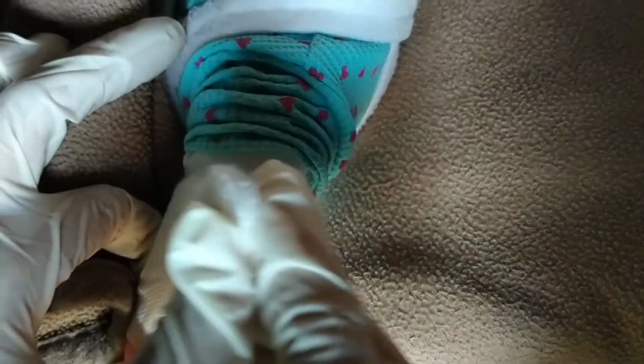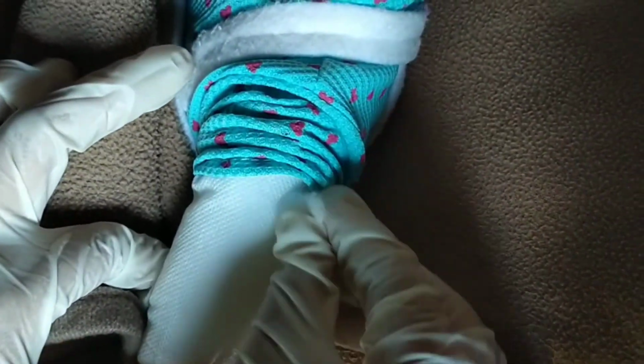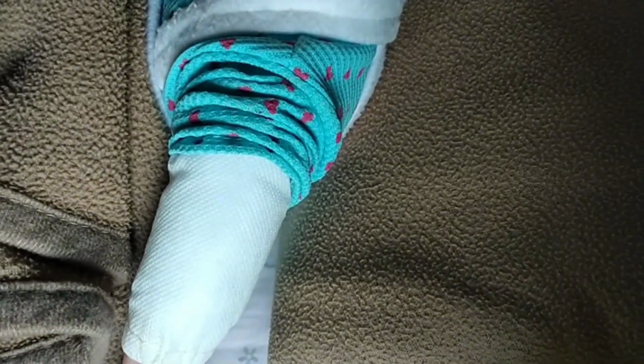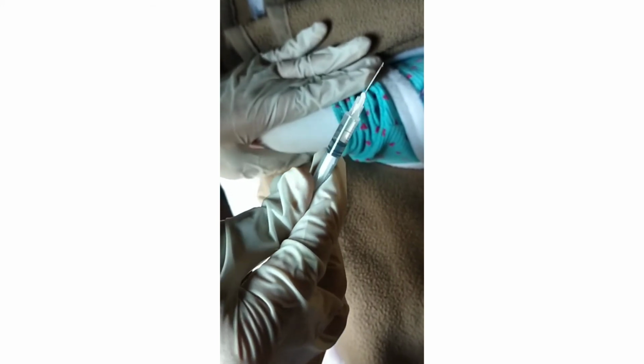Clean the site with an antimicrobial swab, wiping with a firm circular motion and moving outward from the injection site, and allow the skin to dry. Remove the needle cap with the non-dominant hand by pulling it straight off. Grasp and bunch the area surrounding the injection site or spread the skin taut at the site. Hold the syringe in the dominant hand between the thumb and forefinger and inject the needle quickly at a 45 to 90 degree angle.